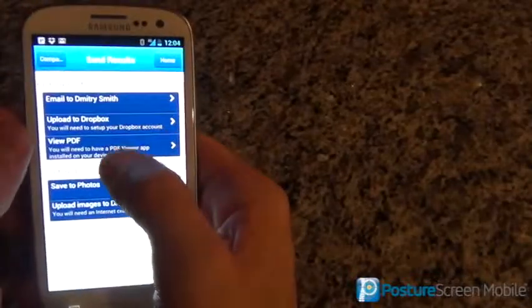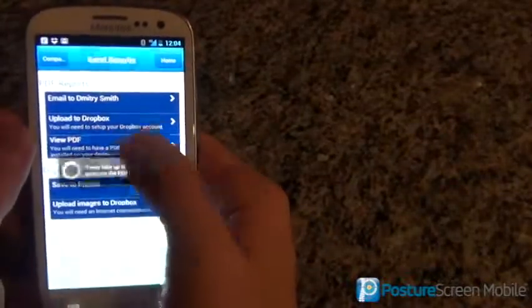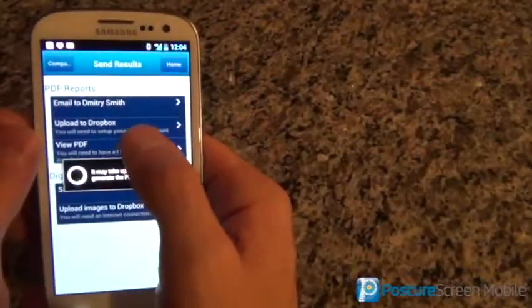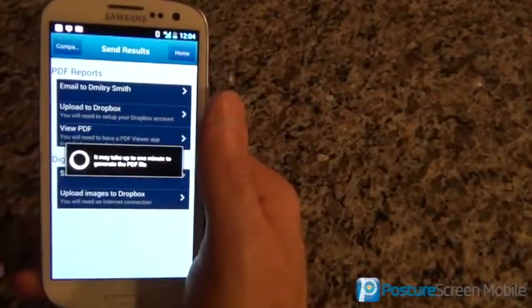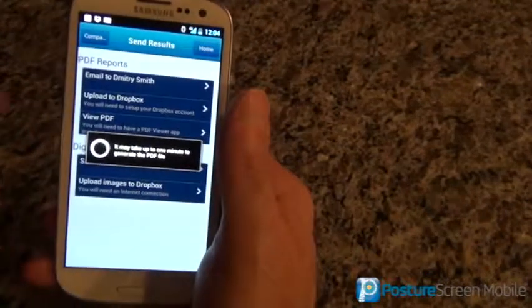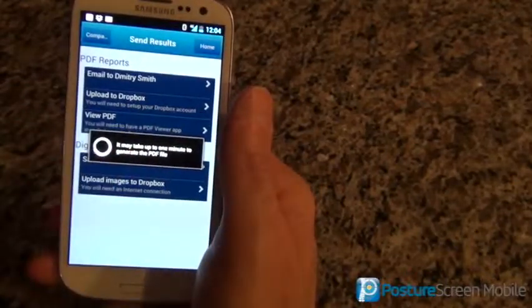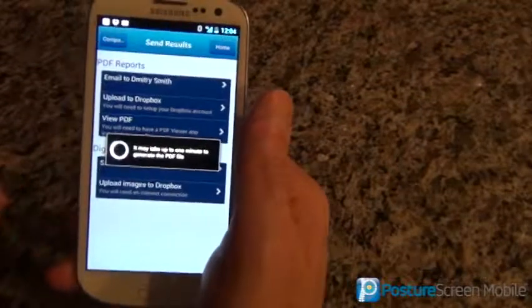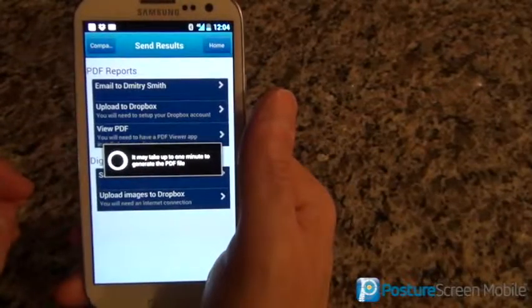Now at this point I could email, generate a PDF, whatever we need to do. I'm just going to go ahead and generate the PDF. We could also upload it to Dropbox if we like. We can save the images — if I choose that button and save the images or upload those images to Dropbox, it's going to do both images. This is a comparison, so it's going to make both images into one JPEG image so that way you can have it for your documentation.